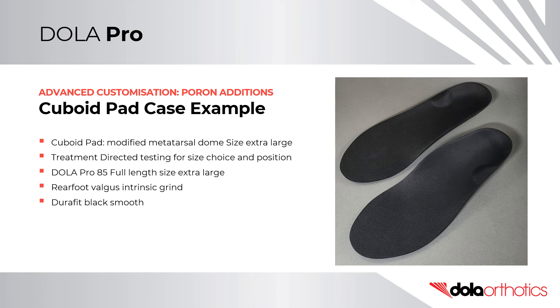In this case example, a size extra-large Poron metatarsal dome was modified for a cuboid pad and was placed on a size extra-large DollarPro 85 high density full length orthotic shell. The size and position of the cuboid pad was selected after successful treatment directed testing on the shoe insole. The prescription was completed with an intrinsic rearfoot valgus post of 4 degrees and covered with a black Durafit smooth full length top cover.